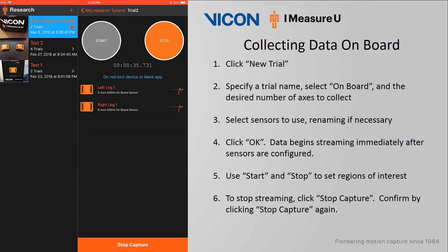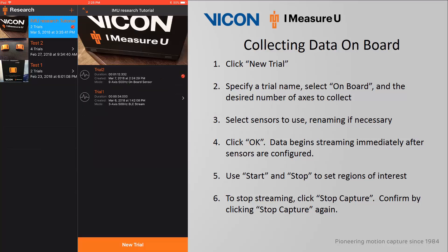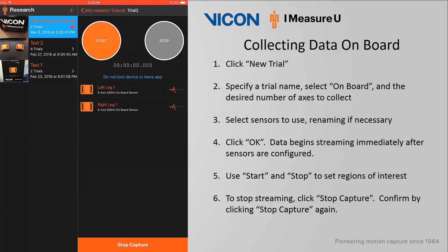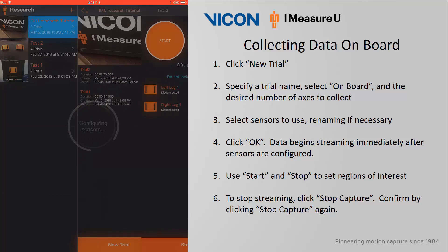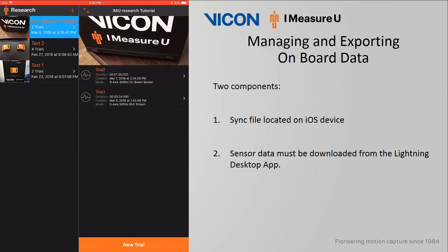When ready to end the region of interest, click Stop. If I click on the session, you will see that data is still being stored to the onboard sensor memory for this trial. In order to stop recording, re-enter the trial and click Stop Capture. You will be prompted again to confirm, so click Stop Capture.